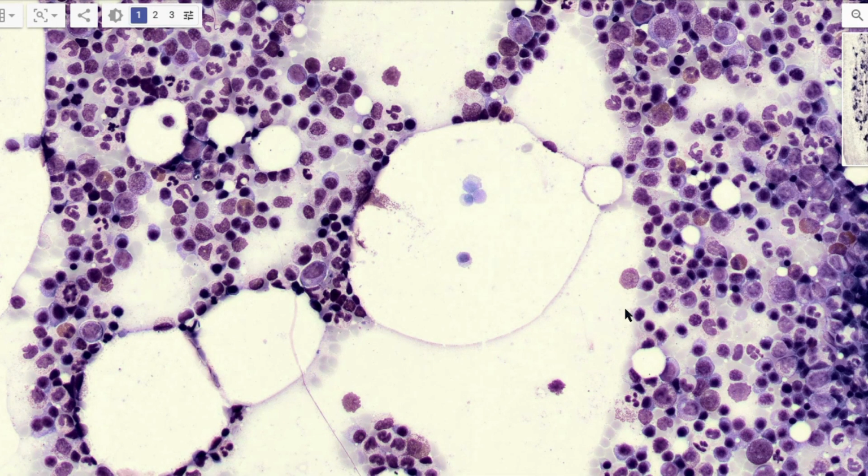peripheral blood smear, being part of the essential criteria for the diagnosis of plasma cell leukemia, which is the presence of 5% or more circulating plasma cells in peripheral blood smears in patients otherwise diagnosed with plasma cell myeloma.